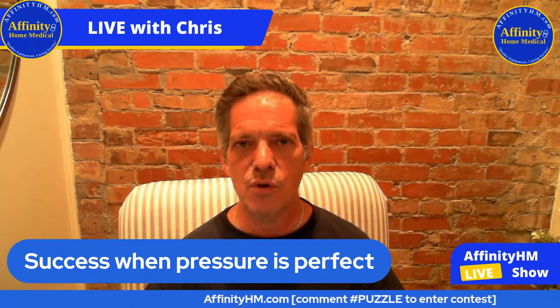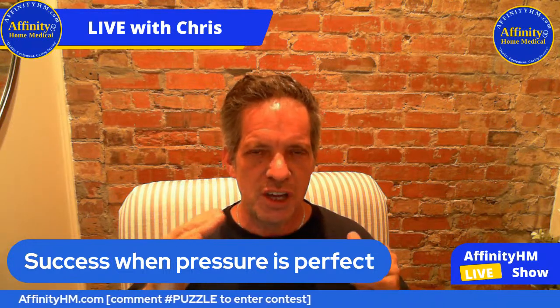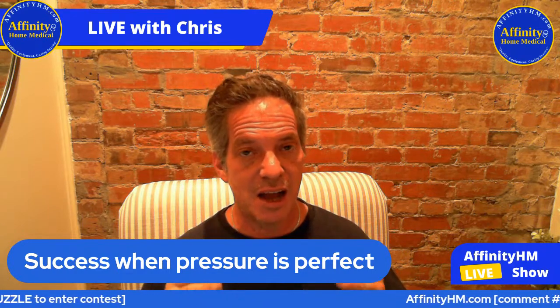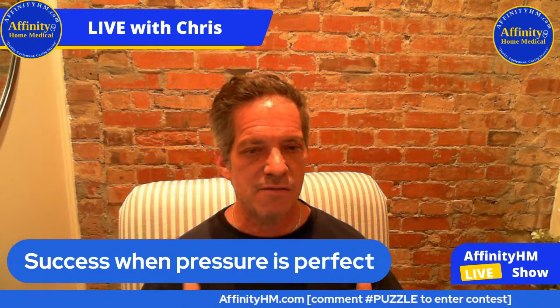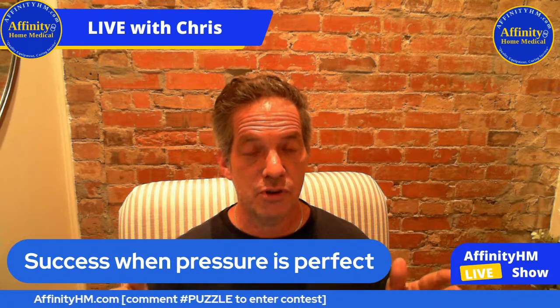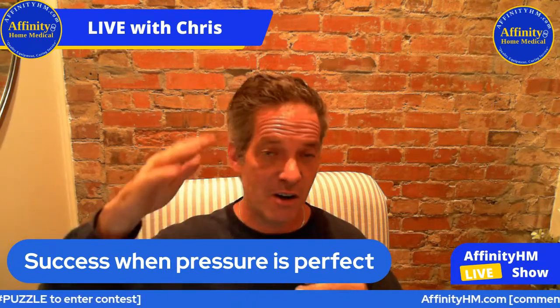What we're discovering is that the narrower you can make that range, as long as it's accurate for your best and optimal pressure, the better. If you have a CPAP that's set at a super wide range, like the doctor prescribed 4 to 20, that's a very wide range.